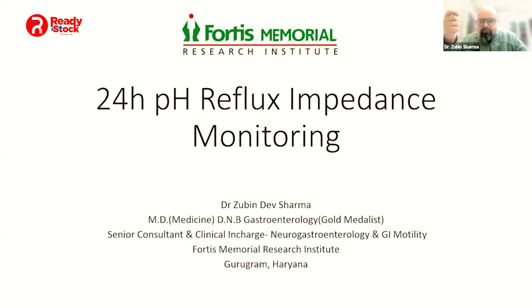You may be doing it for planning of an endoscopic treatment. And you may be doing it in terms of lung disease. So there are a lot of clinical situations where you would be doing this. And that is why manual interpretation becomes extremely important when you are evaluating a pH impedance study.